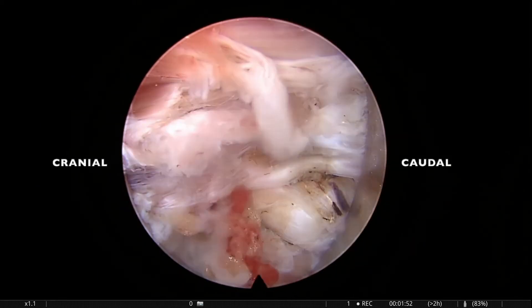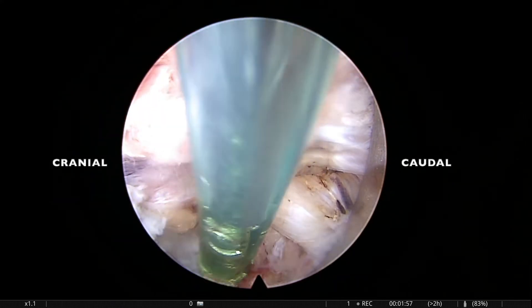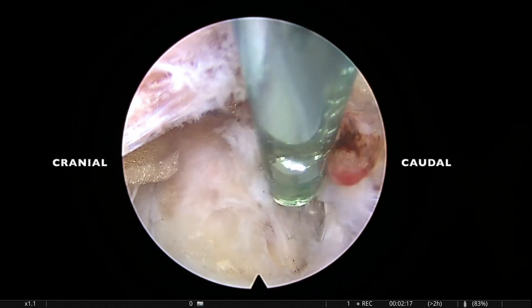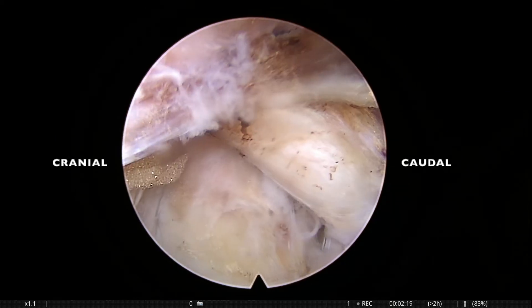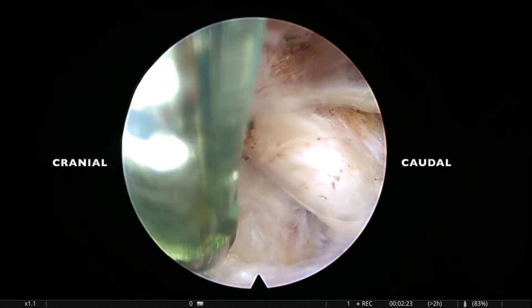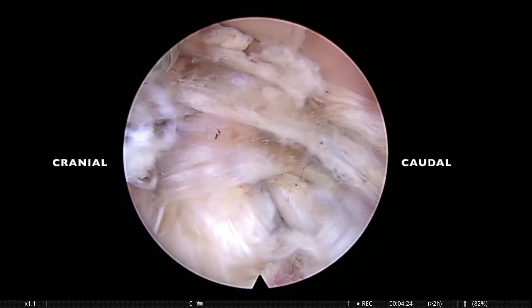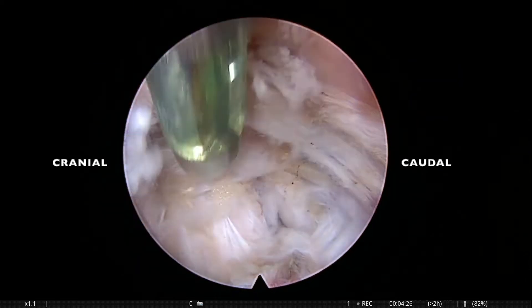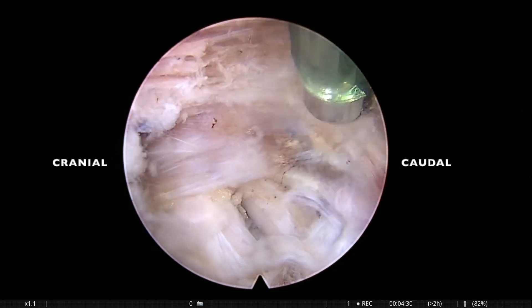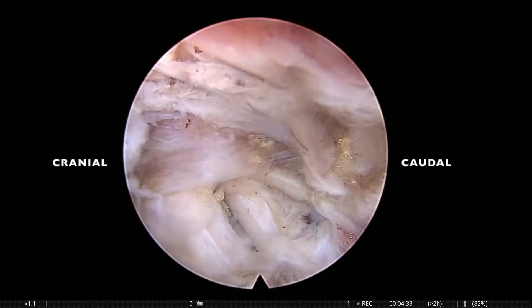We work in the area where the fragment is situated, somewhere between the 6 o'clock and 9 o'clock positions. Once the dissection is done with the radiofrequency you can see the disc surface and the exiting root being covered by the cannula. The annular opening is defined in the center of our field.